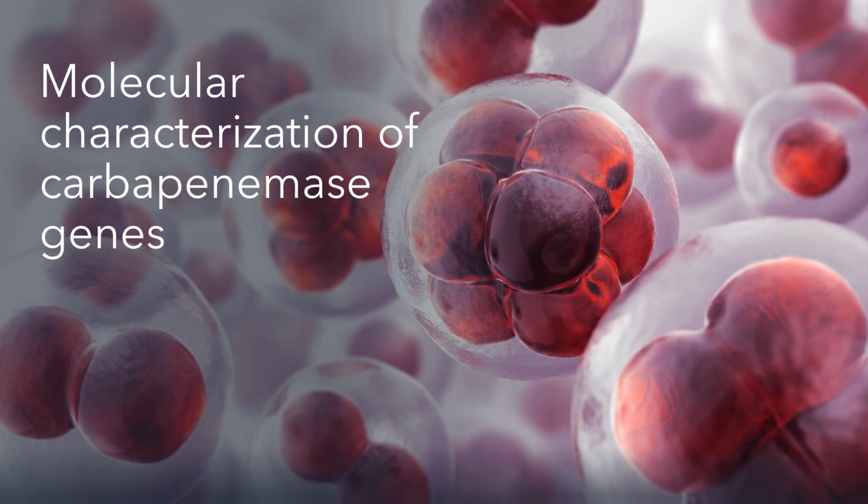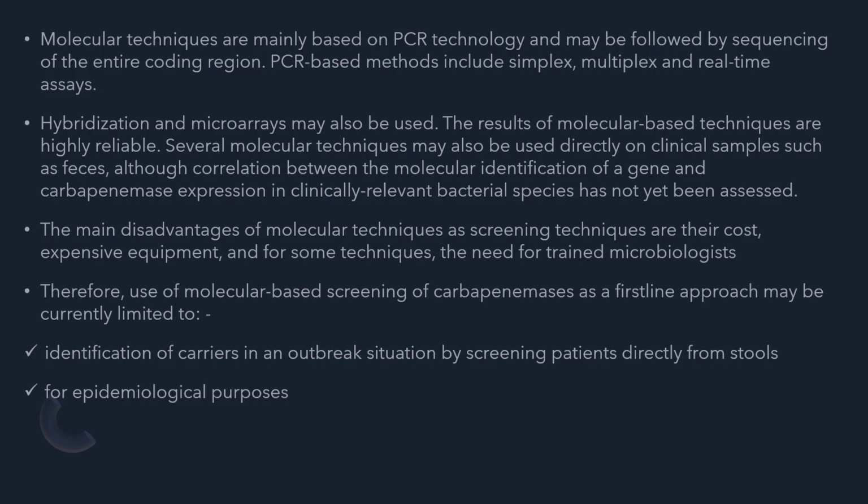What is the molecular characterization of carbapenemase? Molecular techniques are mainly based on PCR technology and may be followed by sequencing of the entire coding region. PCR-based methods include simplex, multiplex, and real-time assays. Hybridization and microarrays can be used. The results of the molecular-based techniques are highly reliable.